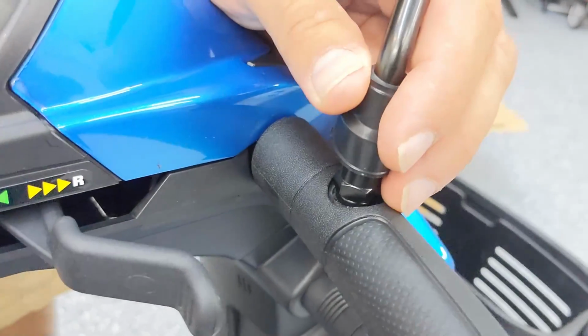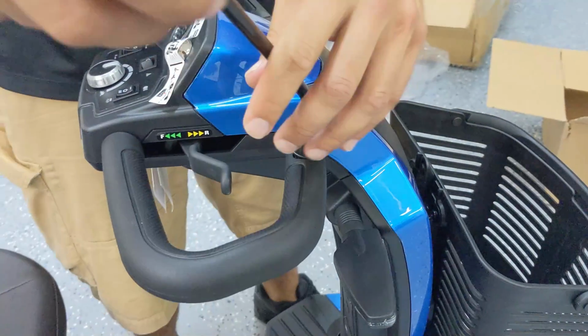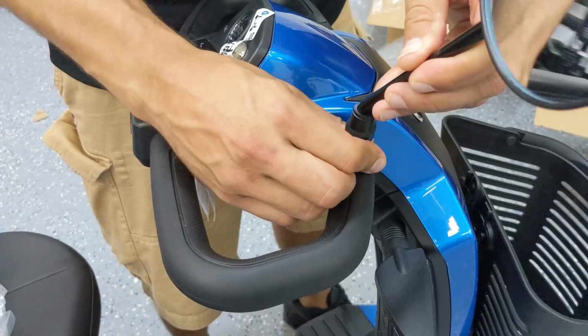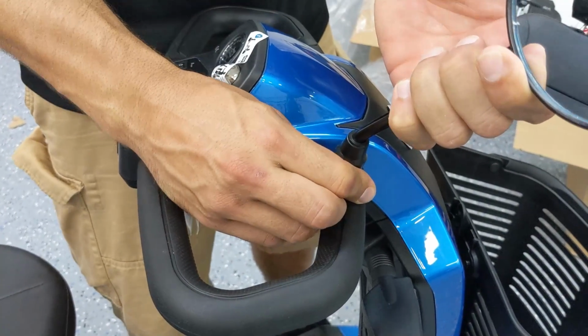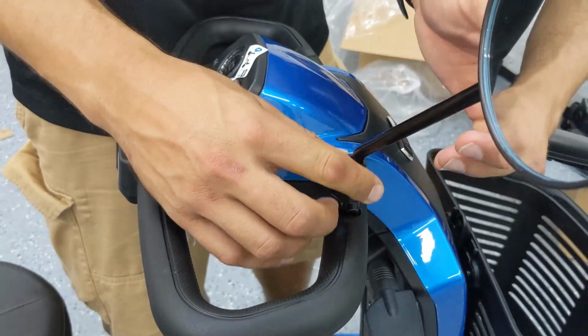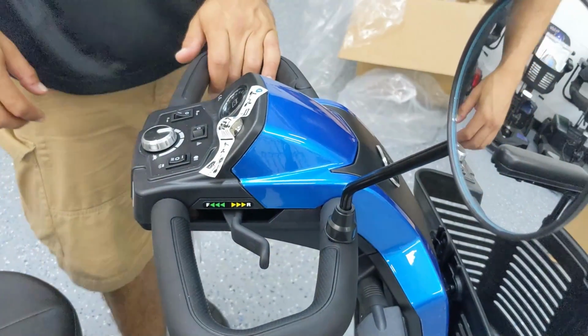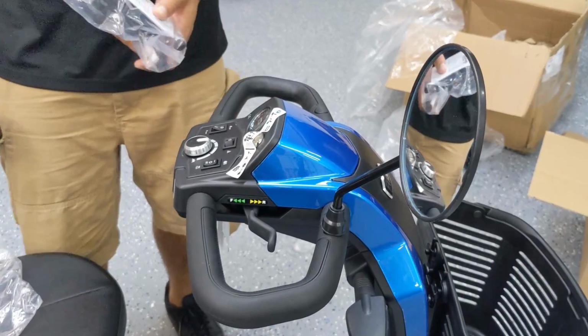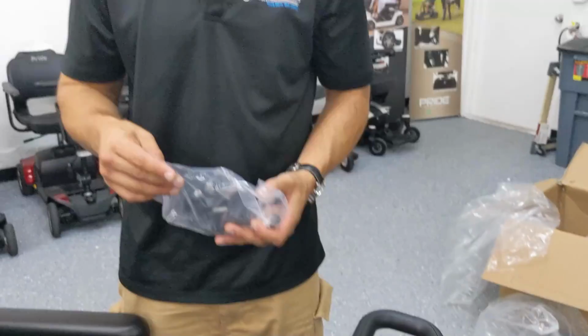and you can spin the mirror around to face any direction you want. Once it gets to a certain point, you may have to hold the mirror in place and then twist it at the base, but it's very simple. It's just like screwing something into the wall, like something to hang a picture. There's really no trick to it.